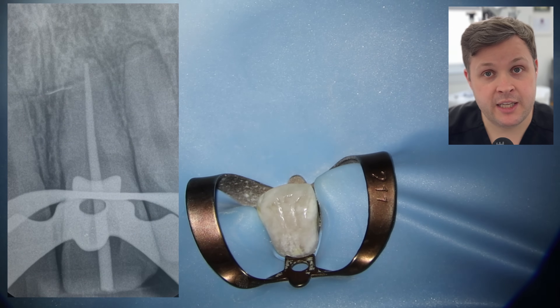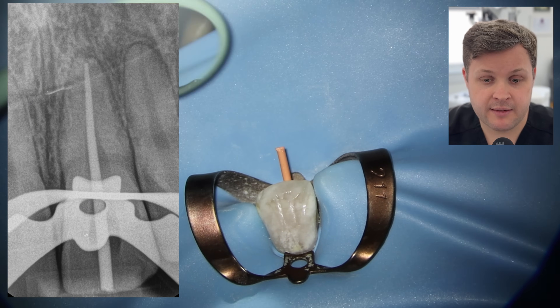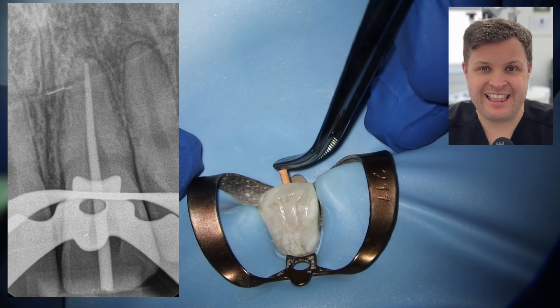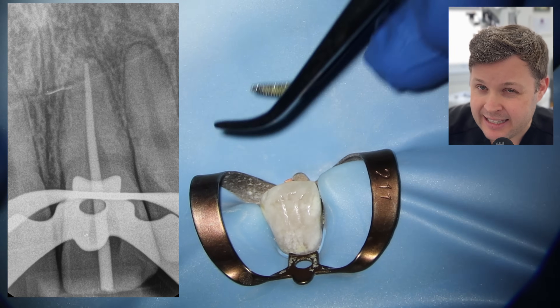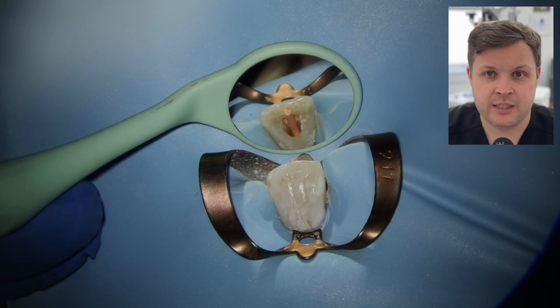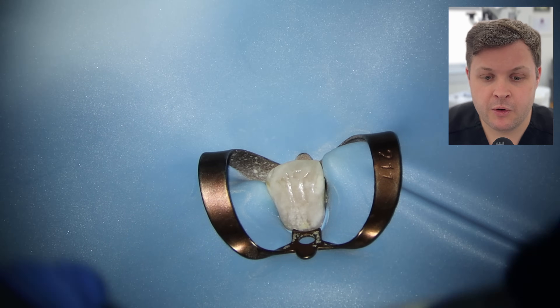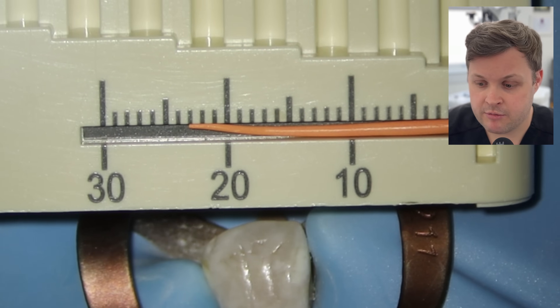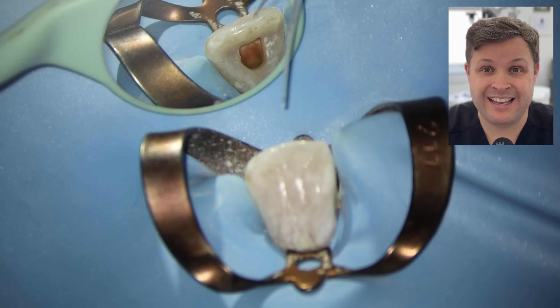So I'm just going to go up one — I'm going to cut it to 40; it was 35 before. When I place this cone to length, we can now see we're kind of at the correct working length within the radiograph — maybe slightly, slightly shorter than the radiographic apex. But we're happy that this is within the canal space itself, and when we use our bioceramic it's going to fill this space up nicely. When we remove the GP cone and measure it, we know it's 23. So now we know the working length is 23 and the apical diameter is 40.